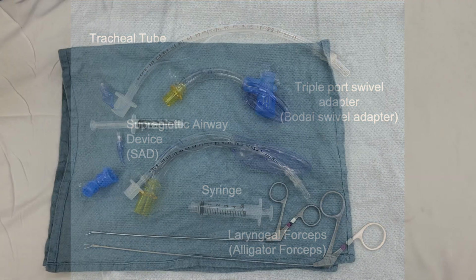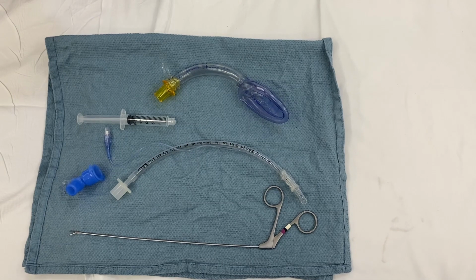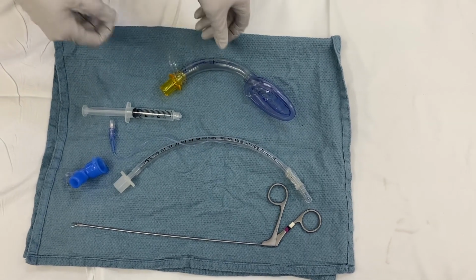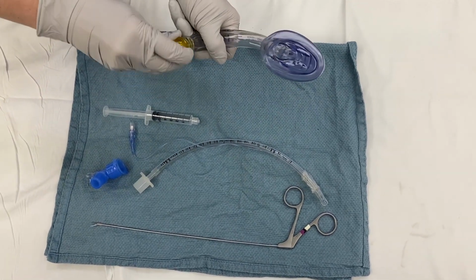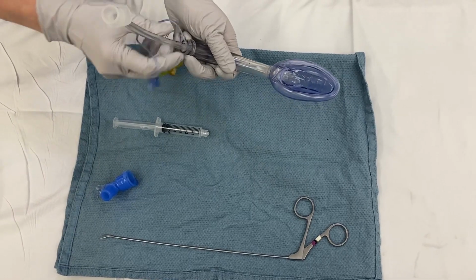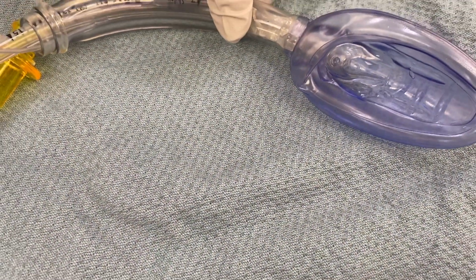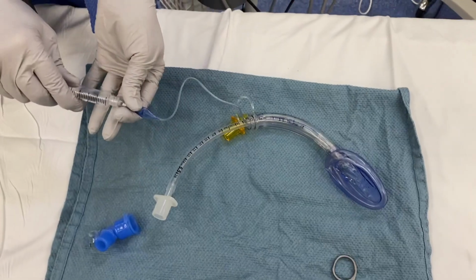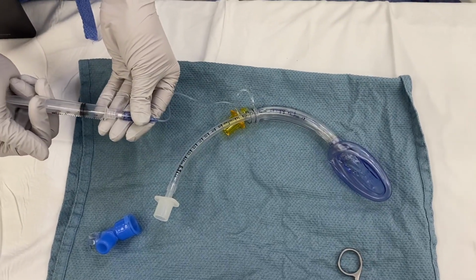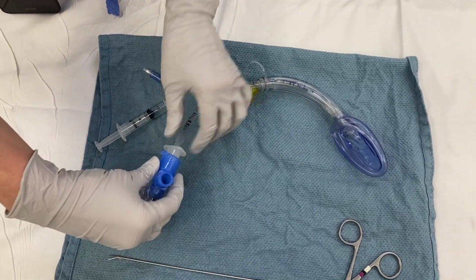So we're now going to set up the air-Q laryngeal airway as if we were going to be intubating through it. So Bistra, she'll pick it up, disconnect the connection point, and then place the endotracheal tube into the device and have it so the tip is literally just at the tip of the bowl. And if you just pull that back a little bit, Bistra, so there we go, just there, and then inflate the cuff of the ET tube, and that now forms a seal within the lumen of the LMA, and then place the swivel adapter.